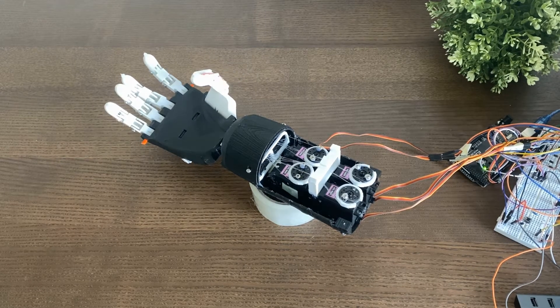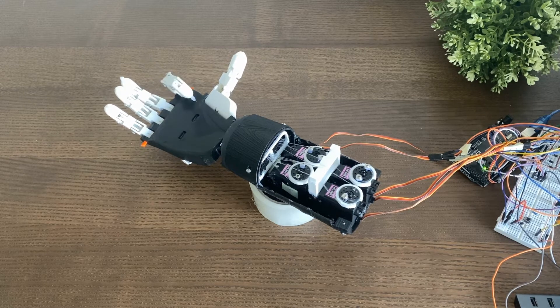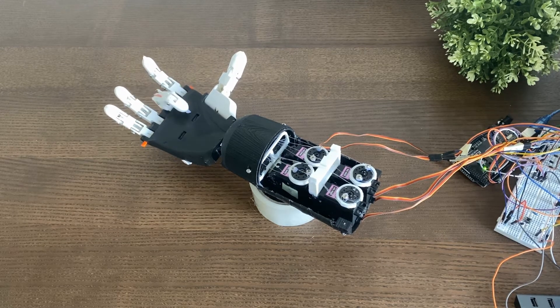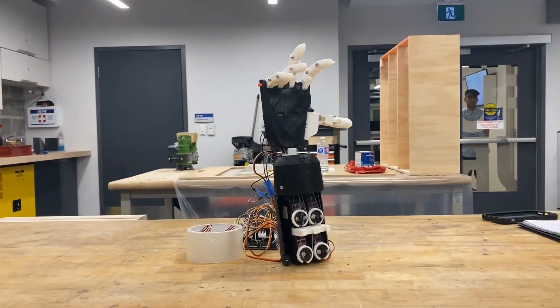This is a proof-of-concept prosthetic arm that I've built for a startup project. I felt it would be an intriguing piece of content to talk about this year — some of the things I learned, how I built it, and what are some of the functionalities of this arm that you're seeing.